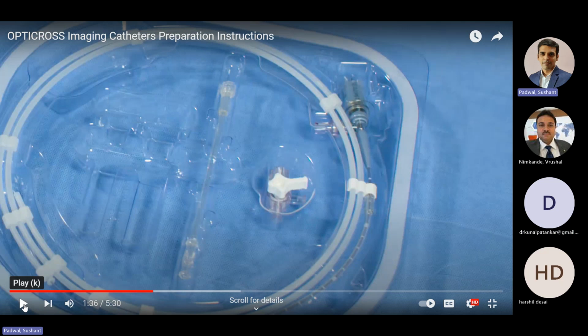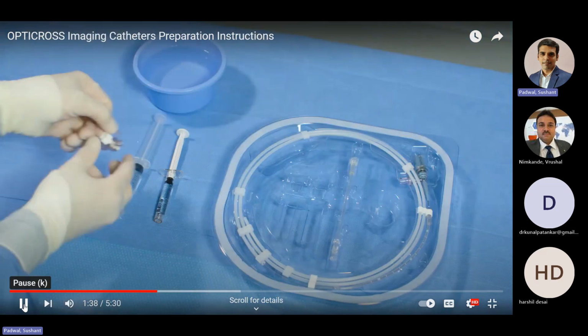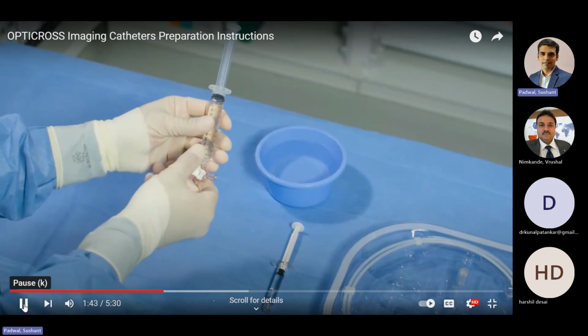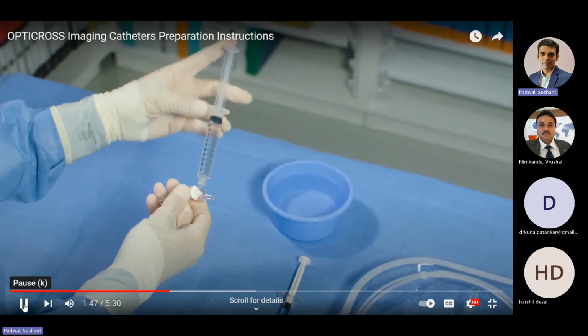Yes, I'll start the video again. Connect the filled 10 cc syringe to the 12 o'clock position on the stopcock. Perform a wet-to-wet connection with the filled 3 cc syringe to the 3 o'clock position.